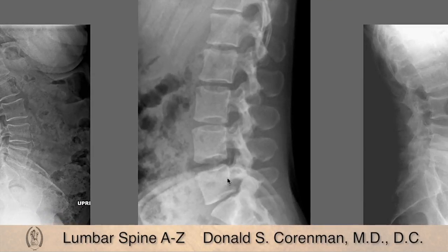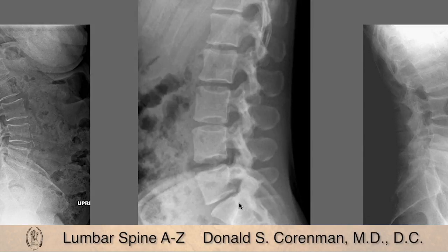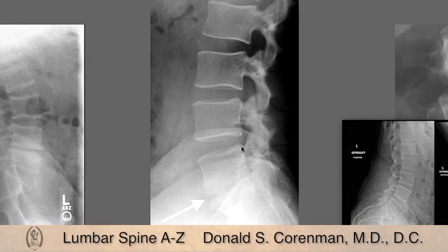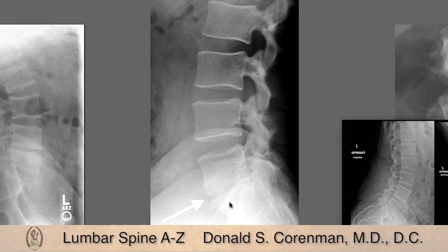Again, on the lateral we can see cascadingly larger disc heights as we go down until we get to L5-S1, which is quite narrowed. This is not isolated disc resorption, but this is significant degenerative disc disease. Here's another x-ray where we see the cascade getting larger as you descend to L4-5, and then at L5-S1 the disc is very narrowed with some sclerosis of the end plates and the intervertebral areas, indicating isolated disc resorption.